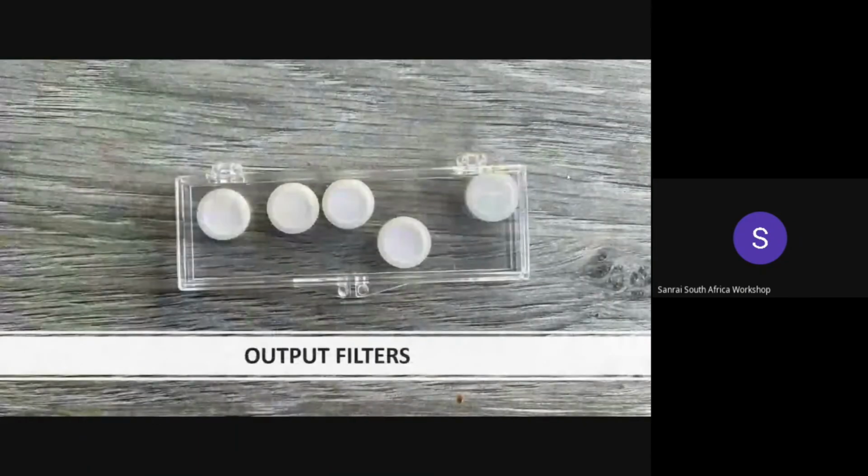We also have the output filter. This is also a final stage filter that is found in portable machines. The output filter is located just underneath the cannula bulb of those small portable machines. These filters are not reusable and may be replaced yearly if the machine is used by one person. If the machine is used by different people, then it should be replaced between patients because there may be some bacteria coming from the patient during inhalation that might be trapped on the filter. If it's used by the next person, they could easily get infected.